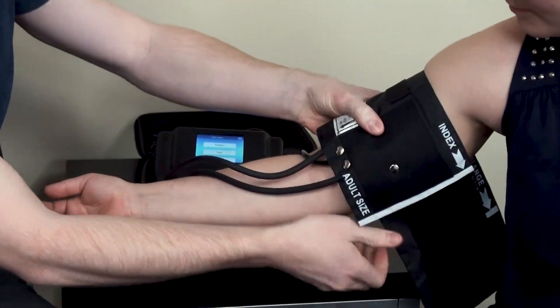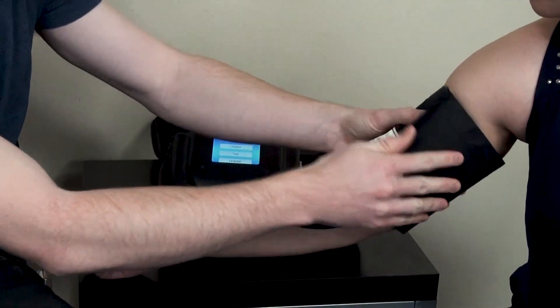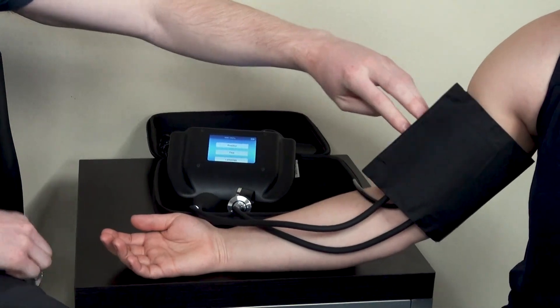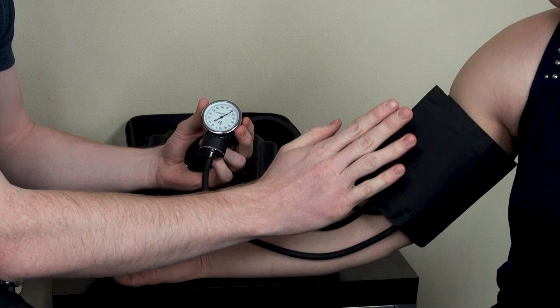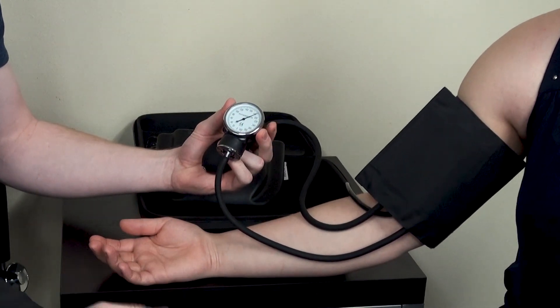This cuff can be used on a student, mannequin, or the standard patient in a healthcare simulation setting. The cuff does not actually inflate, so a student can wear this for a full class period and not have to worry about circulation.